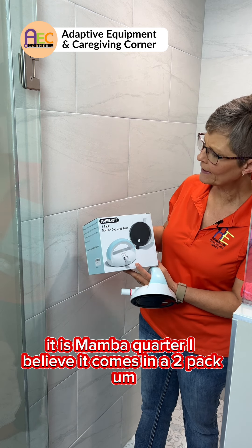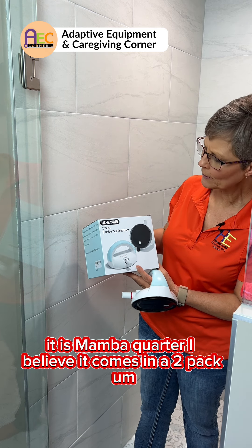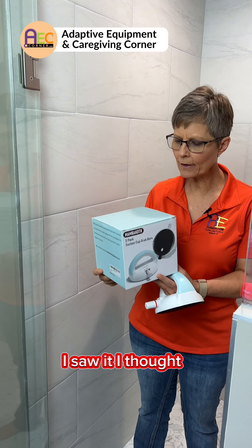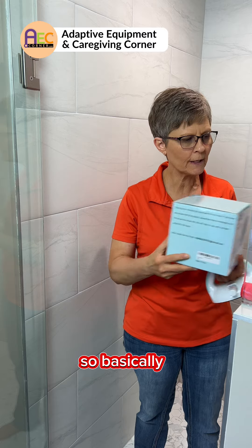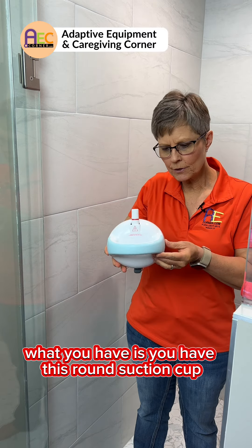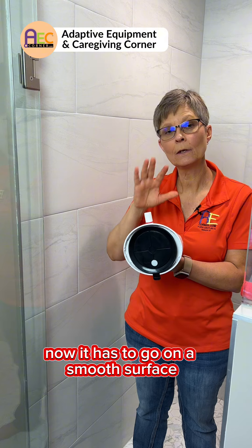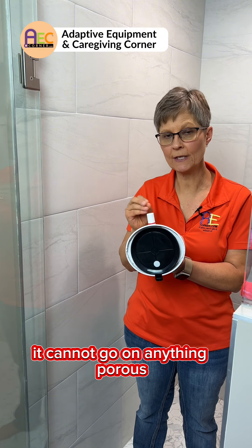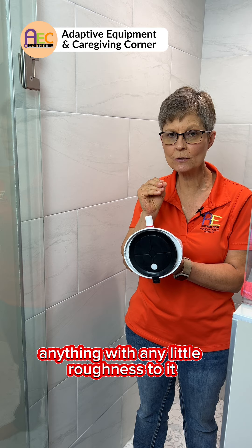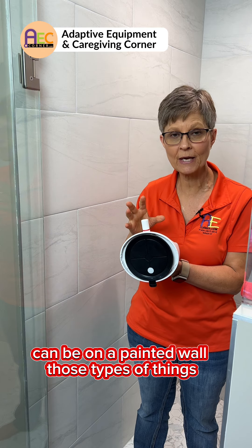Trying this one out, it is Mambakotr — I believe it comes in a two-pack. Basically, what you have is this round suction cup. It has to go on a smooth surface. It cannot go on anything porous, anything with any little roughness to it, or a painted wall — those types of things.